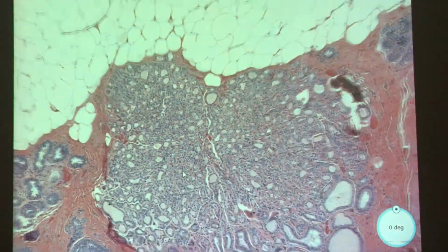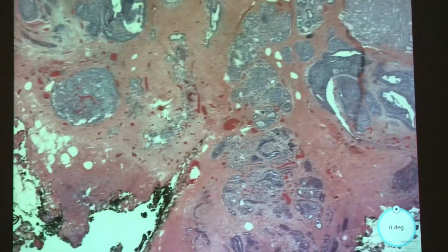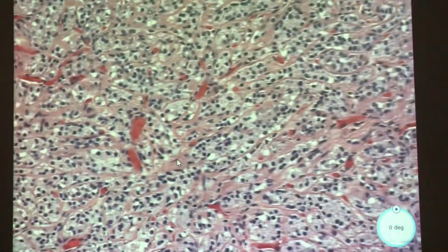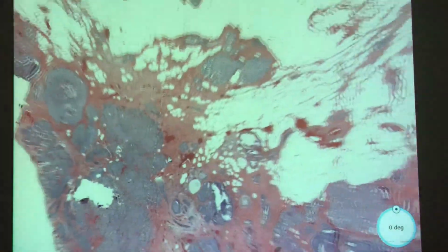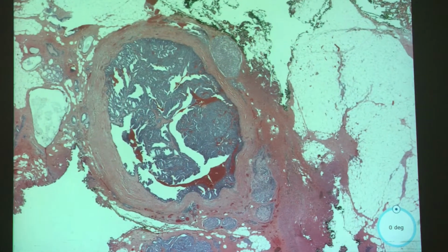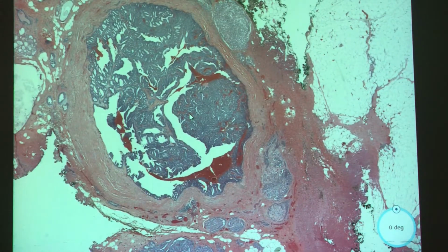Because we went over adenosis and how terrifying it can be. And there's a little more of the papilloma. So this thing just kind of keeps going. And there's some more adenosis. I thought that was part of the lesion at first. Yeah, exactly, at low power. I guess this is the star. We're not going to take too much away from it. All right.